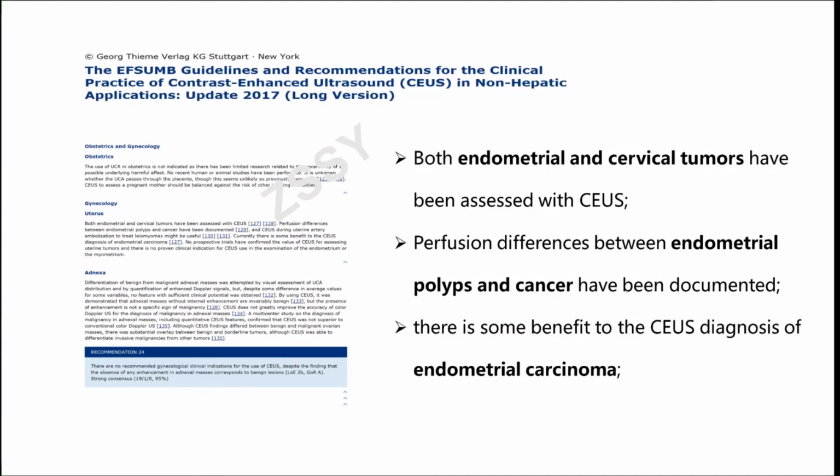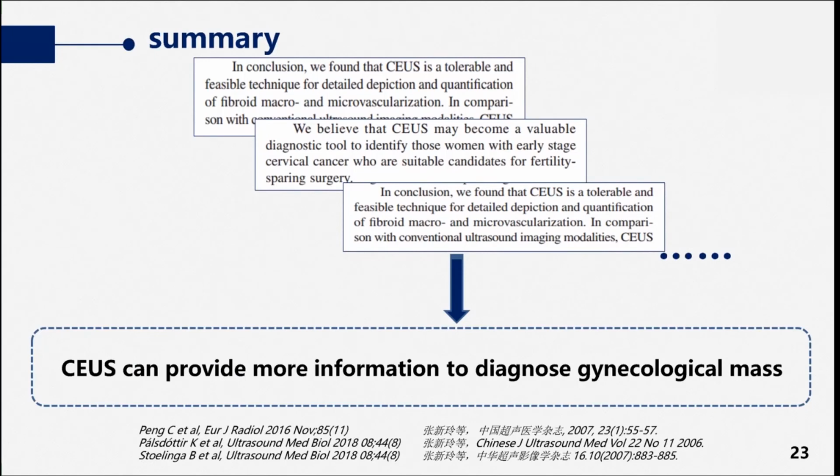Overall, the guideline of CEUS in non-hepatic applications has shown the usefulness of CEUS. CEUS can provide more information to diagnose gynecological masses in complex clinical practice. As the guideline has partially admitted its value in the diagnosis of gynecological masses, but more study is needed.